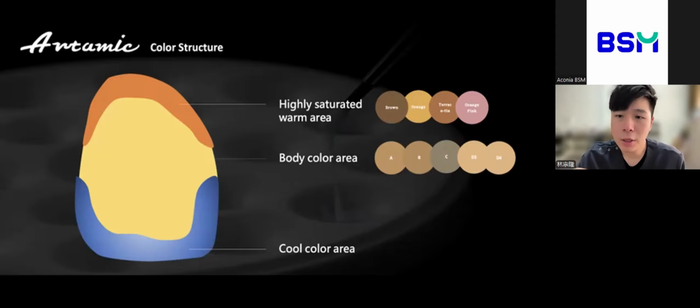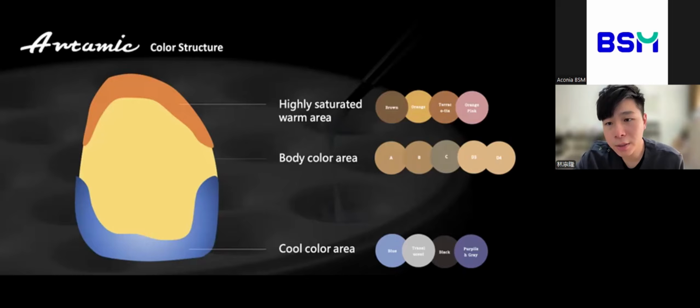The most commonly used color is blue, but in the standard system, the blue is just one shade, closer to sky blue and relatively light. I usually make it with a purplish gray, which is gray with a slight purple tone. Mix them together to lower the brightness and give a deeper, more natural blue. You can also add a bit of black to the blue and apply it to an area of the incisal edge with stronger translucency. This helps create a slightly grayed translucent effect, similar to what you get with the preceding layers.